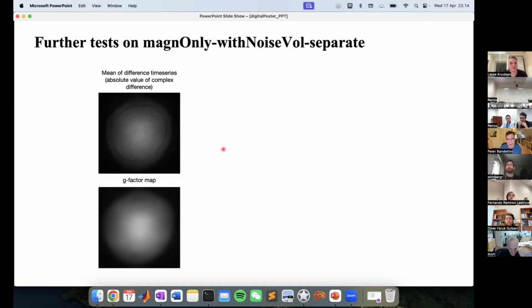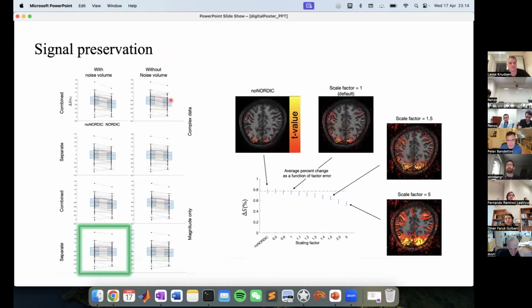Cool. So I had a quick comment. If you can go back to that slide, some people might interpret that yes, the percent signal change goes down, and obviously you don't want that, but they might see the image as, oh, the contrast is still going up because you're detecting all this additional activation that you couldn't detect before. So people might argue that.